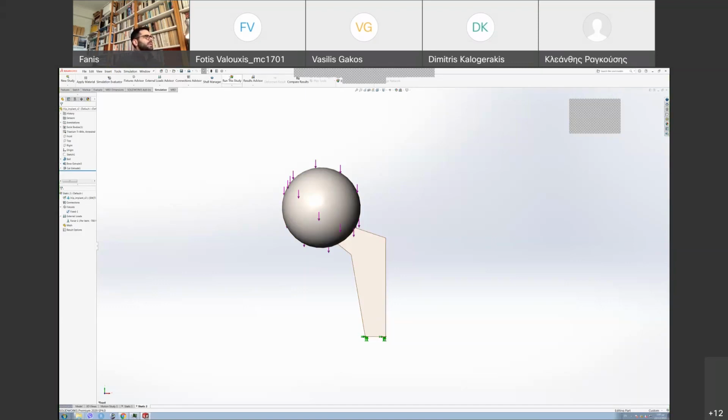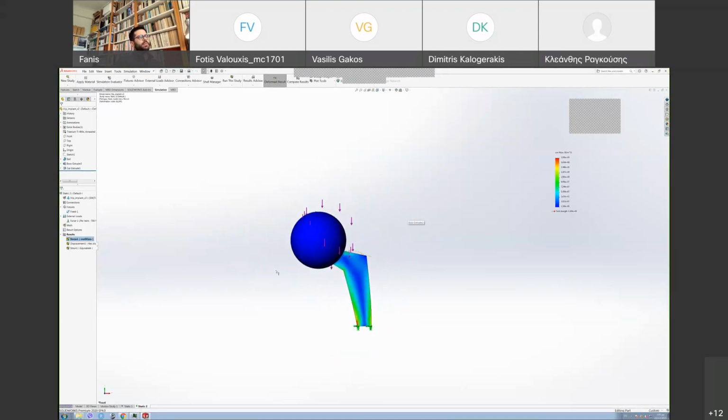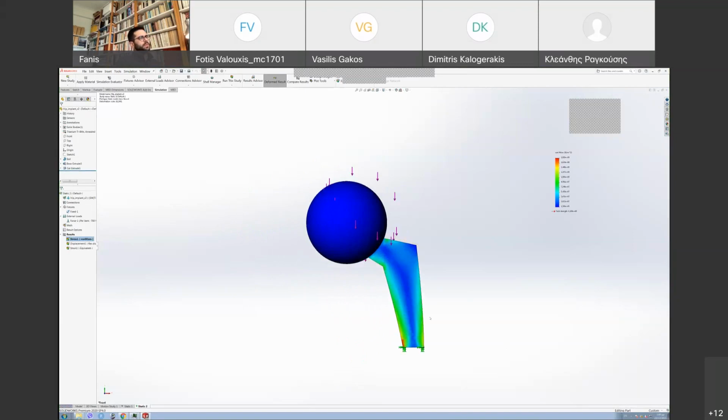So then you can just click run the study. And if I did everything correctly and I didn't mess up the geometry, it should run pretty well, okay? And pretty fast actually. So you end up with these results. This is the stress according to von Mises stresses. You probably know this already.